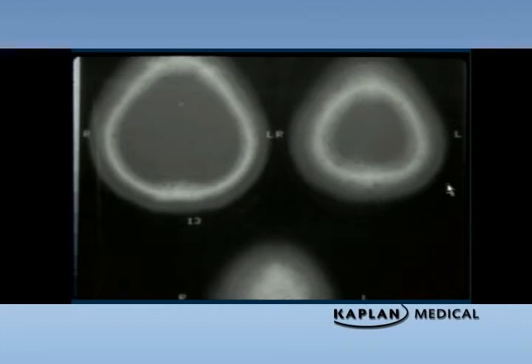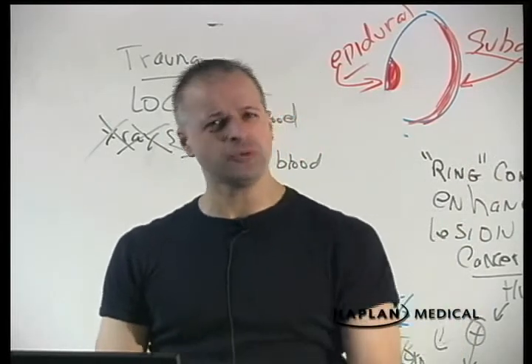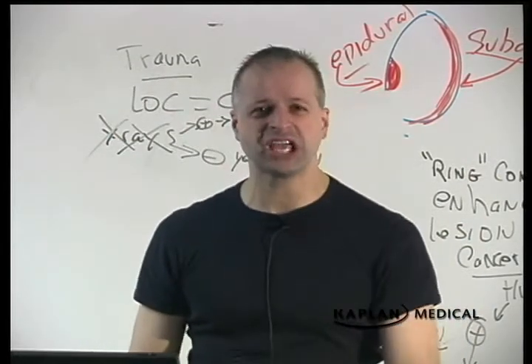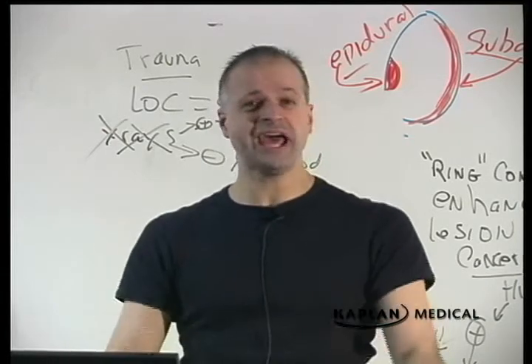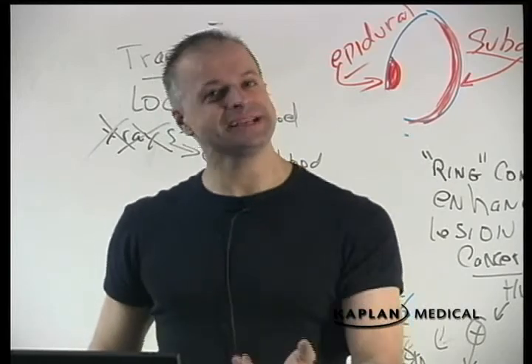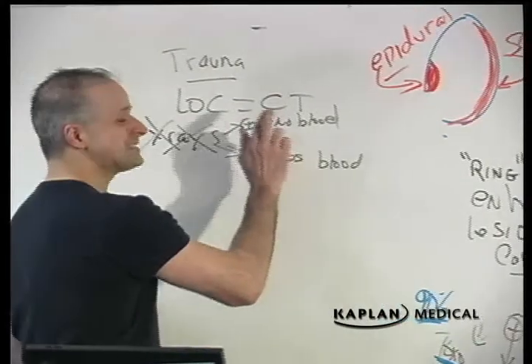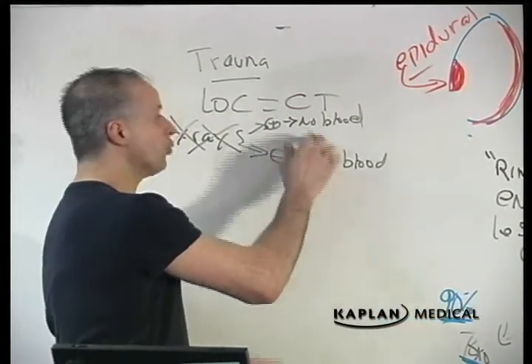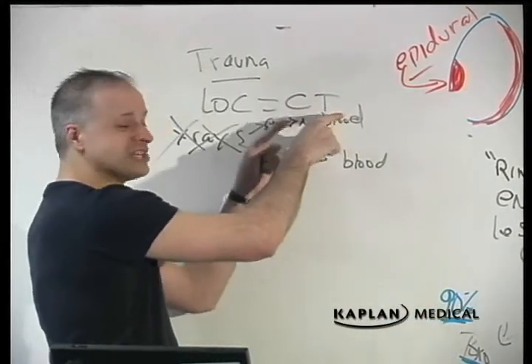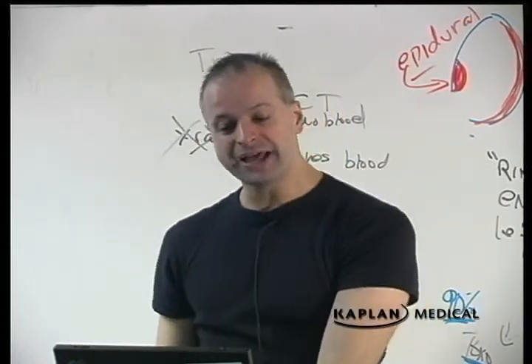Now I know some of you might say, hey, where I'm from, we always got skull x-rays with head trauma. We never got a CAT scan. Well, why not? Because we didn't have a CAT scan. So if you didn't have a CAT scan and you had head trauma, you might get skull x-rays. Just remember, skull x-rays can't tell me what I really want to know, which is, am I going to the operating room to have my blood drained? Myeloma, multiple punched out lesions and lytic lesions.